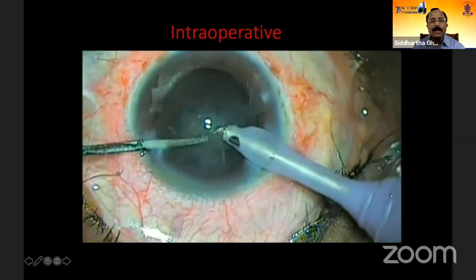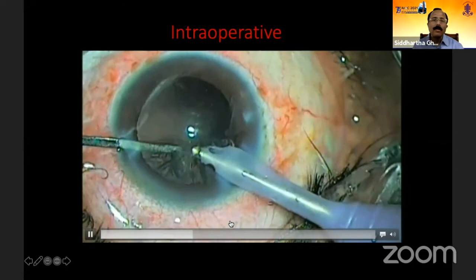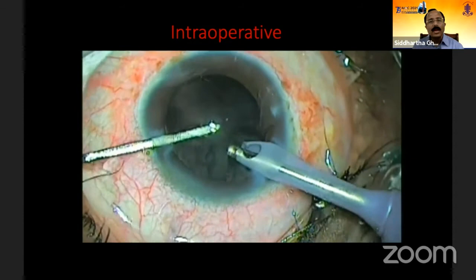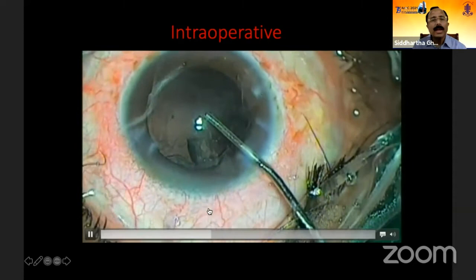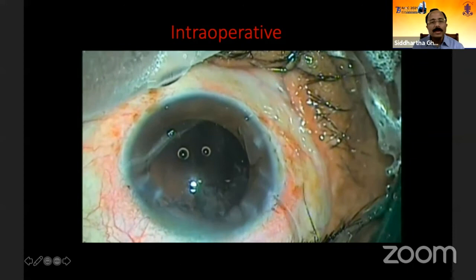And here I would like you to see that the bag is wobbling. It's just floating sometimes. And as you see now, it's still floating. I don't know if you can make out from the quality of the video. And now something has happened, I understand. So I come out and inflate the bag. I want you to see once again, I inflate the bag, it has all come out with viscoelastic. Now I understand I have a little bit of cortex remaining. So I need to stabilize the bag. I could have done it with a pair of capsular hooks as well.